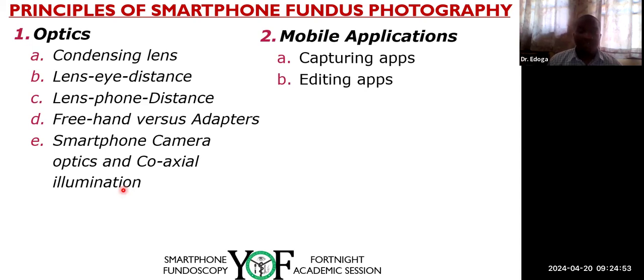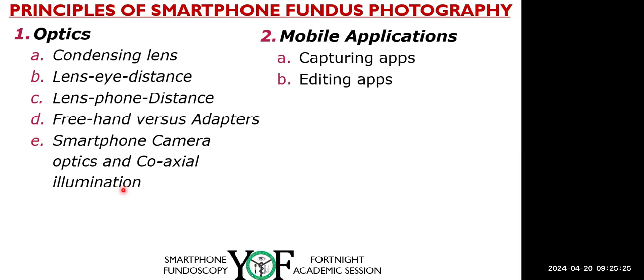And the iPhone, surprisingly, has the type of camera they call retina camera, because it's not just about the megapixel, it's also about the clarity of every pixel in the picture. You can see phones with very high pixel counts, like 50 megapixels, but when you take the image and zoom it, you see that it is pixelating. And if you have that in the retina, and the retina image is pixelated, you're going to lose a lot of details.